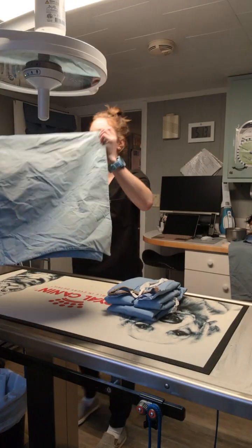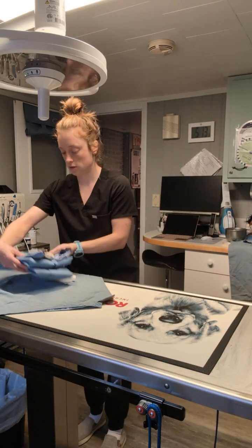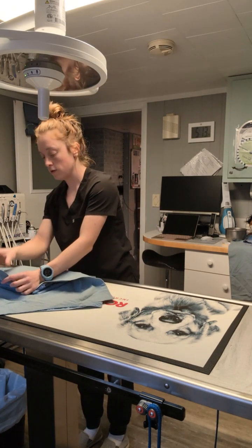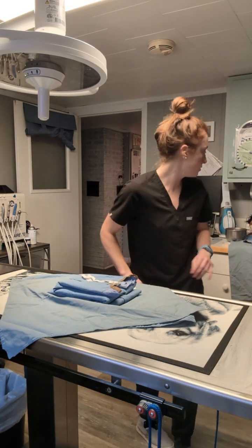Then I'm going to put my pack drapes out diagonally. I'm going to start with the bottom side, fold it up and fold it back. Corner first.